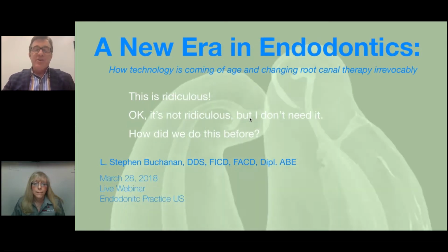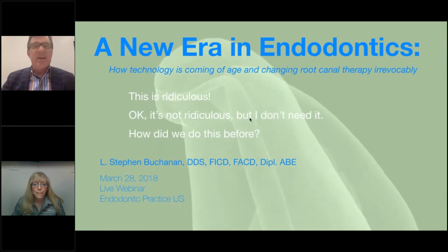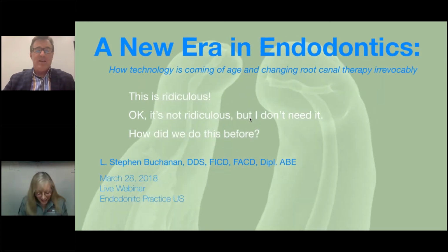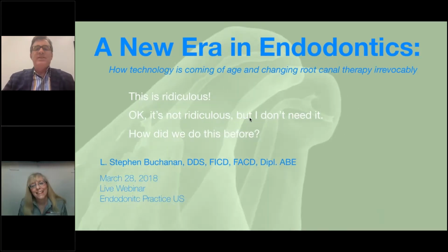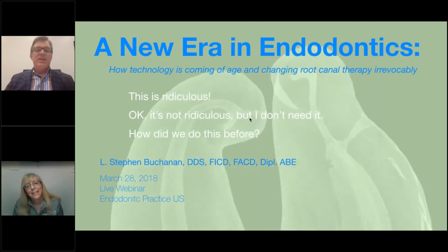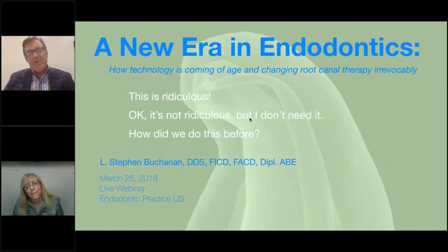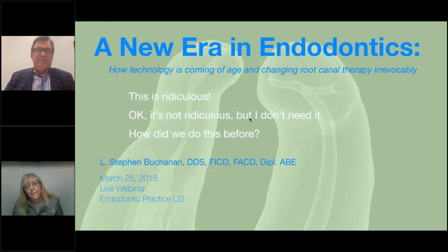So the joke with heads-up magnification is, I really hate looking at people's mouths. I don't do that anymore. I just look up on monitors. It's really hard looking at the mouth. Oh my God, it's so small. It's such a weird place. It's always the wrong angle. It's never the right angle. I can sit a patient up in a chair, have a 3D heads-up system, and not look in there at all, and operate totally blind with a perfect picture of it. So no, that one, extremely short learning curve.